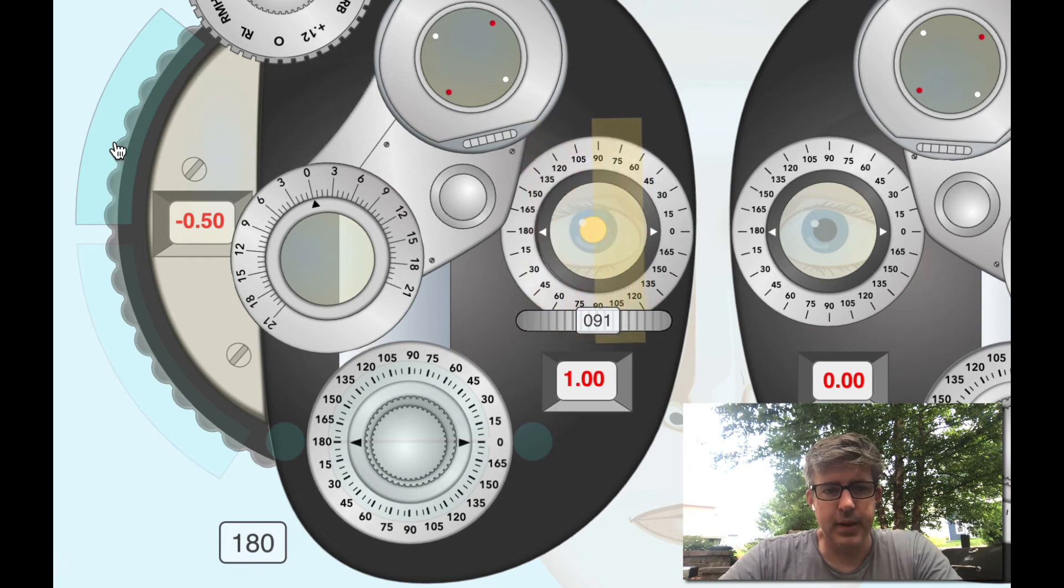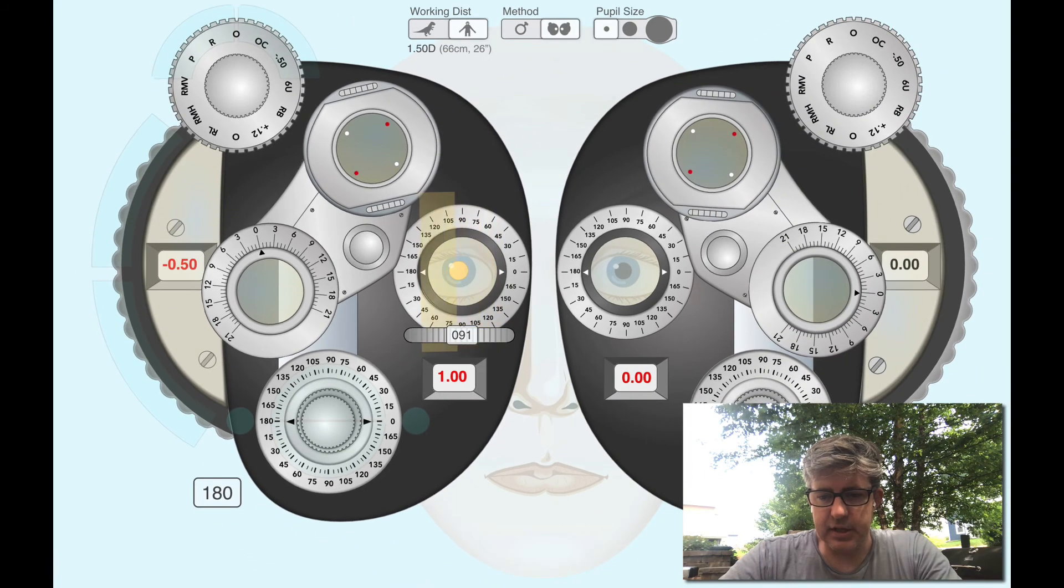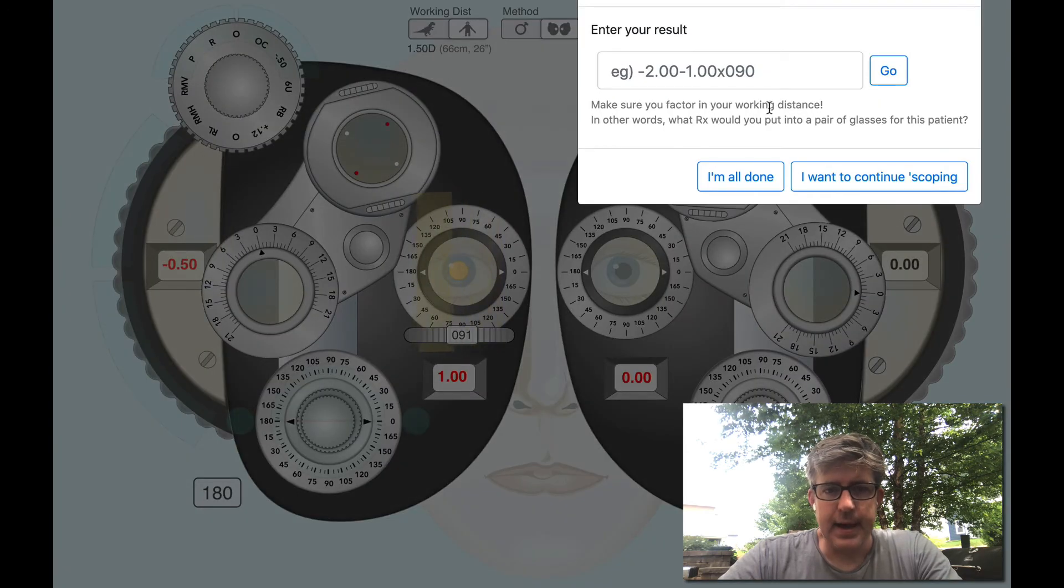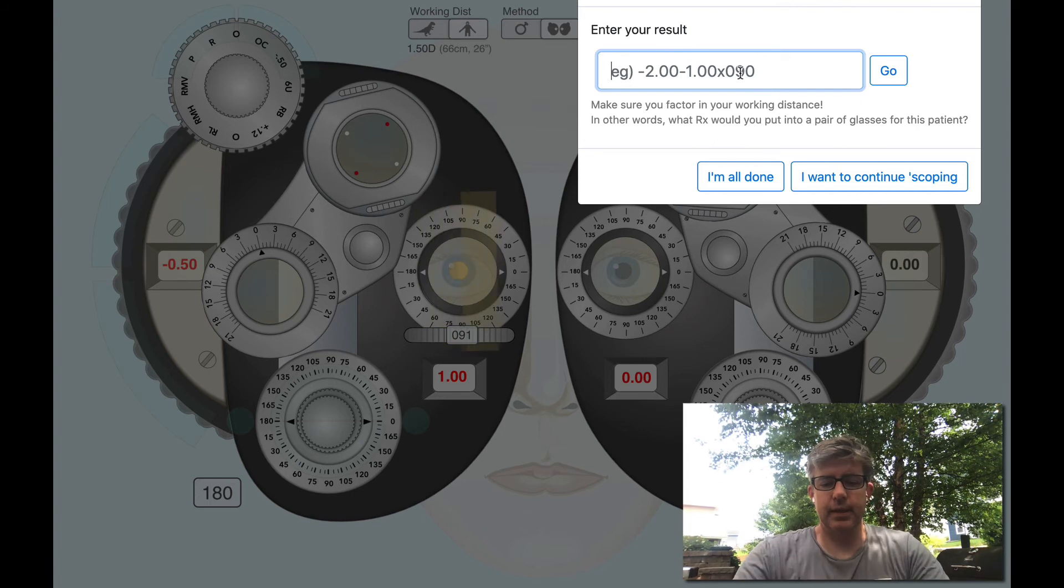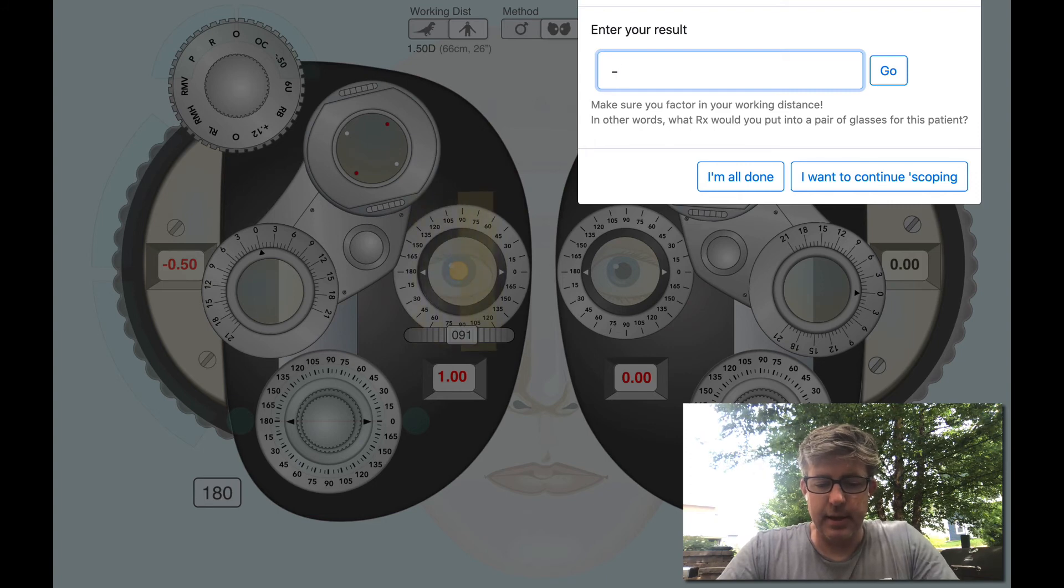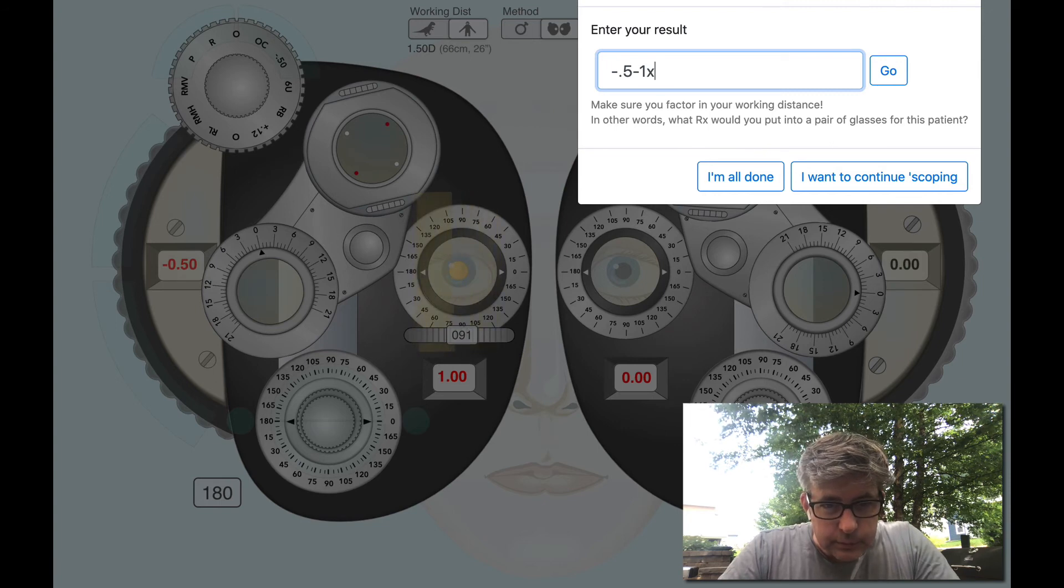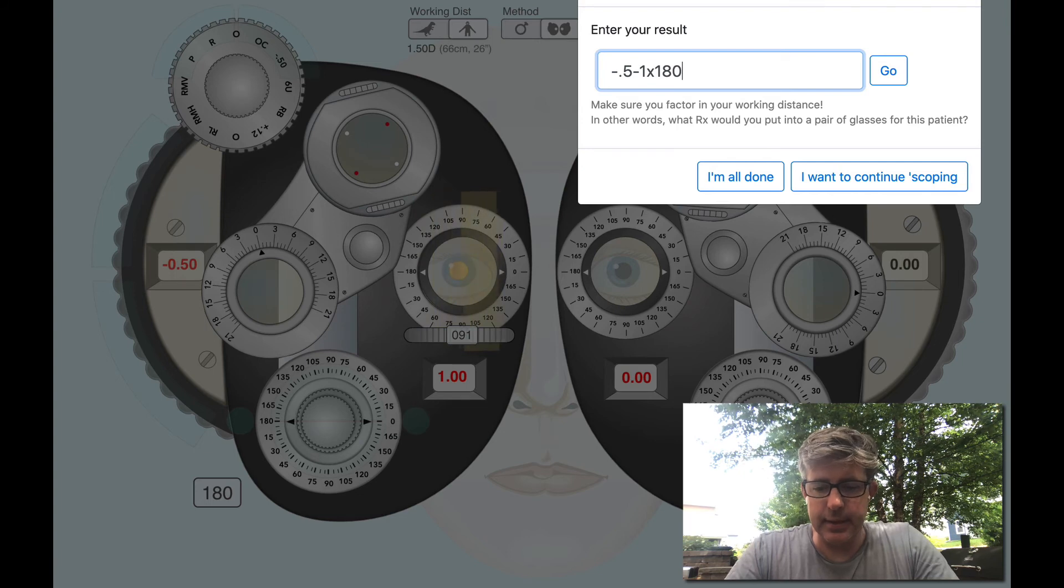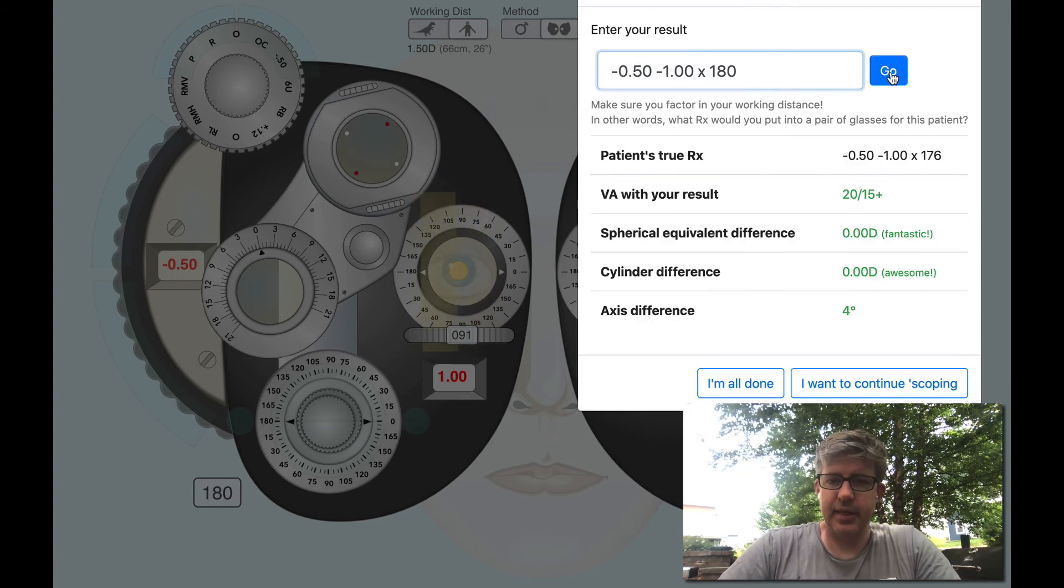Let's see, this is my result. I want to see how I did. I'm going to hit finish. I'm going to put my result in here which should be incorporating the working distance which we've already done. So I'm just going to read right off my instrument. I have a minus 0.5, I have a minus one cylinder, and the instrument axis was 180.